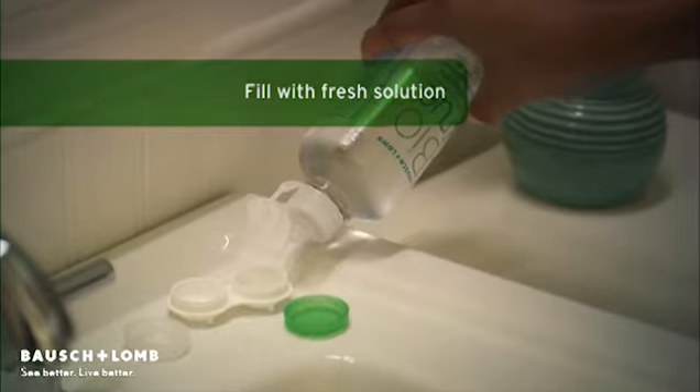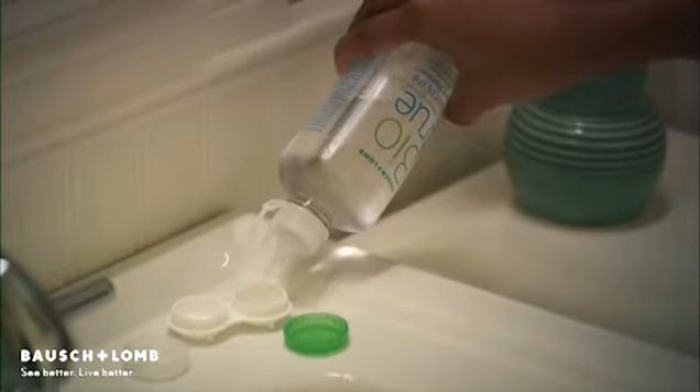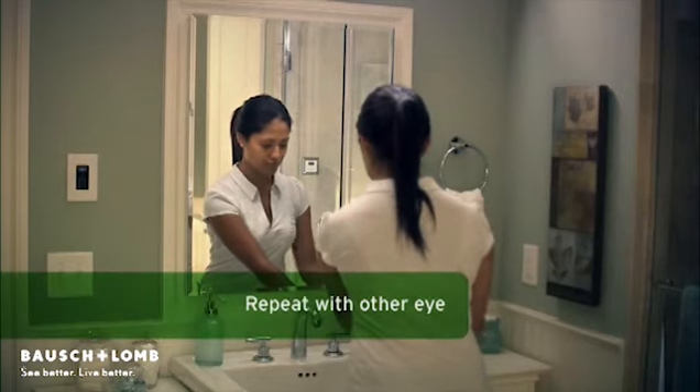Always use fresh solution. Never reuse or top off solution. Then just repeat these steps for your other eye.